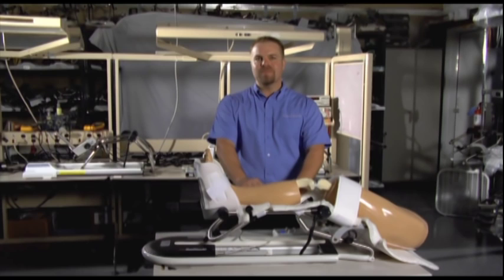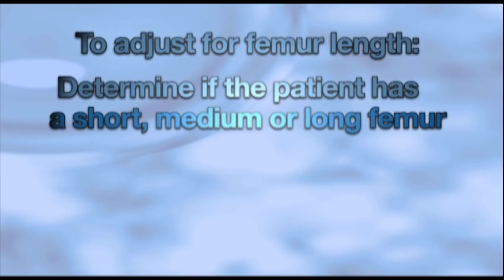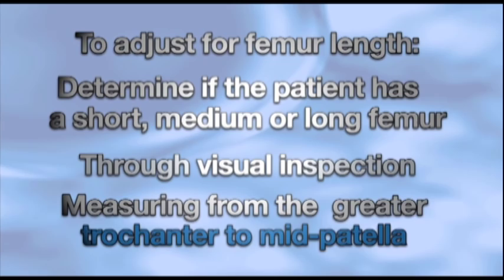Adjusting femur length may be one of the most overlooked steps in fitting the CPM machine properly to the patient. It is, however, one of the most important. To properly adjust for femur length, you must determine whether your patient has a short, medium, or long femur. This can be done by visual inspection or by measuring from the patient's greater trochanter to their mid-patella.